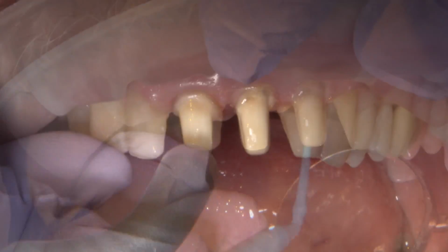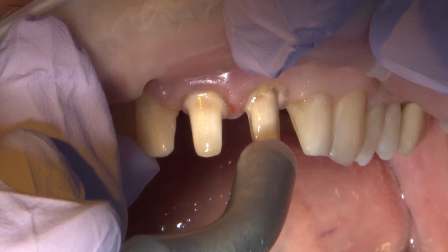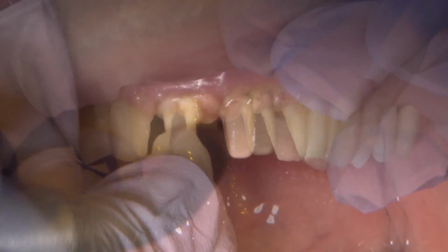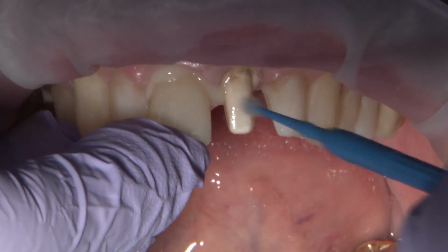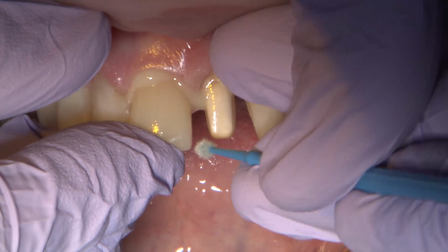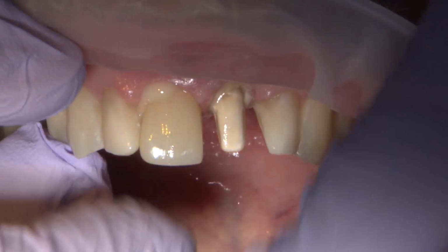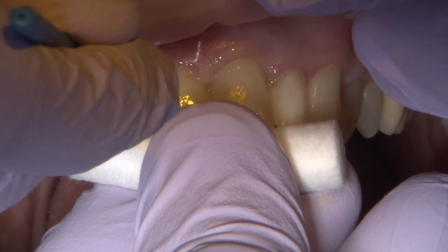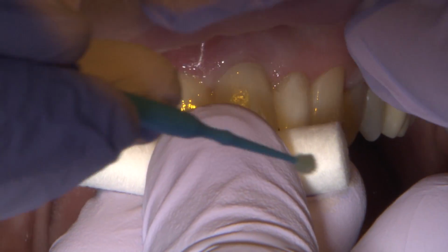And of course, ensure that we air dry, thin it out, air dry, and that will ensure that the solvents within the bonding agent have been evaporated. The BruxZir Anterior material at 650 megapascals of flexural strength is certainly strong enough to allow for conventional cementation with a resin-modified glass ionomer, but I don't want the white and high-valued color of the RMGI to show through our now more translucent crowns. So I do opt to bond these in as well.